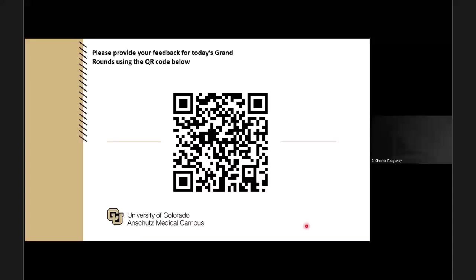So I'm not sure if you guys have a specific order for uploading to PowerShare, but we can typically upload images from there, cross it over to our PACS. As far as actually consults, we're not going to do any consults on chest x-rays, I can say. But as far as the actual upload process, it was a great question that I have never actually had to answer.